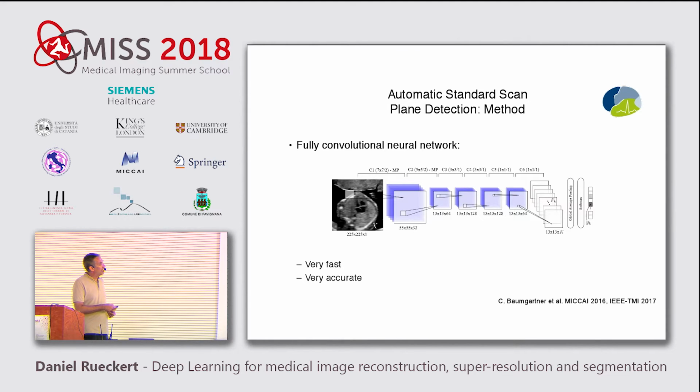A key thing is it produces spatial feature maps at the end. So we have k different classes, typically around 17 or 18 classes, and we produce feature maps which are 13 by 13 by k, and then we perform the final classification using a global average pooling followed by a softmax to basically have an activation for one of these 17 classes.